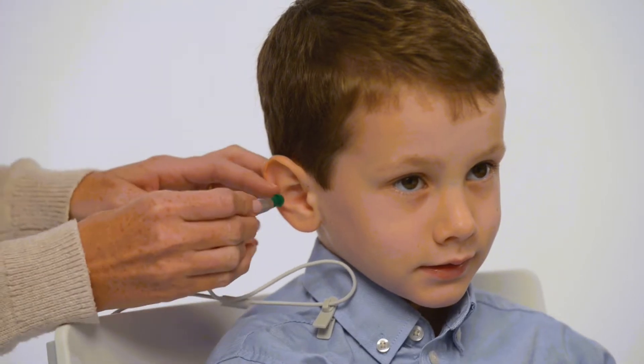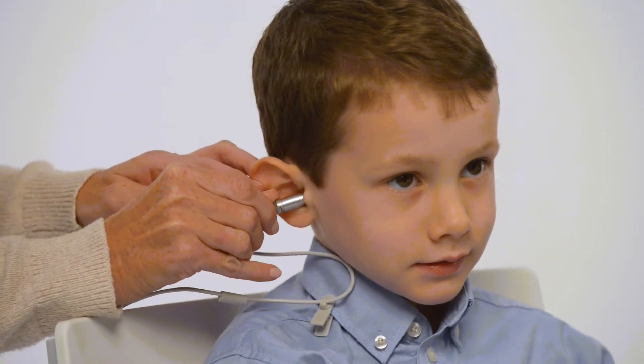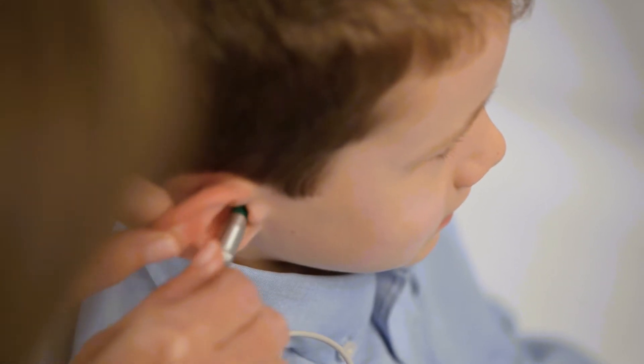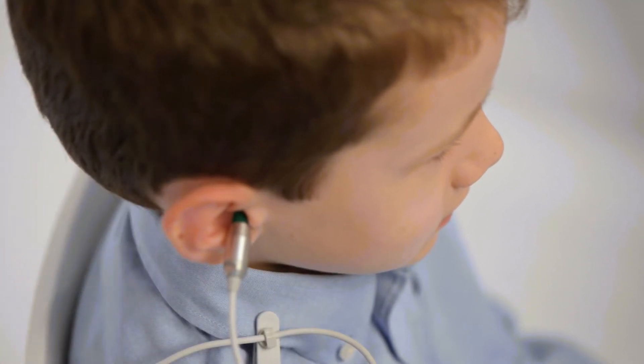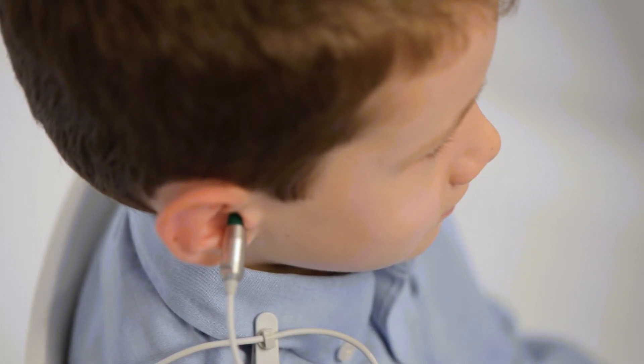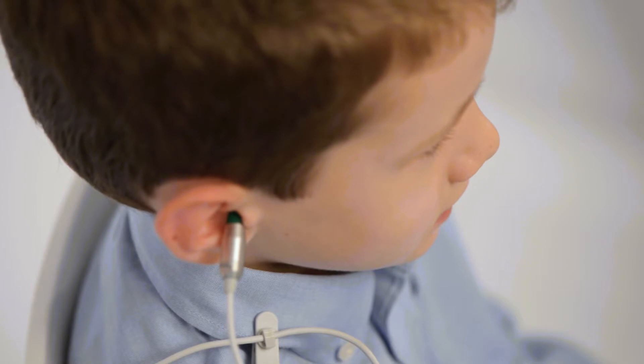To begin testing, clip the probe to the shirt to keep it out of the way. Power on the device by pressing the down arrow and insert the probe into the ear canal by first pulling up and back on the ear. Insert the probe in the direction of the nose and then turn it slightly back, pushing it into the ear canal with a slight twist.